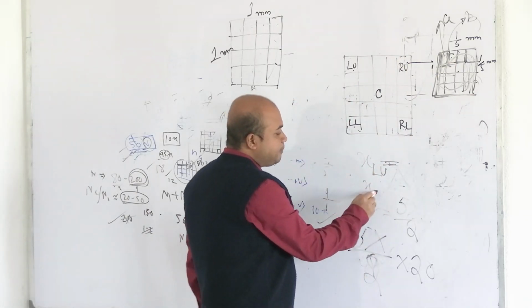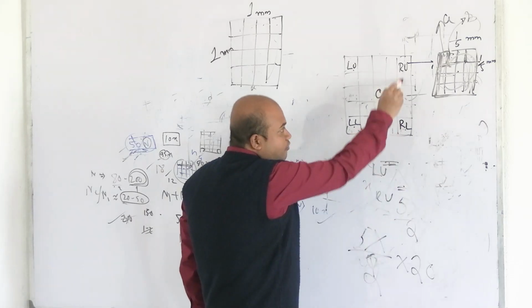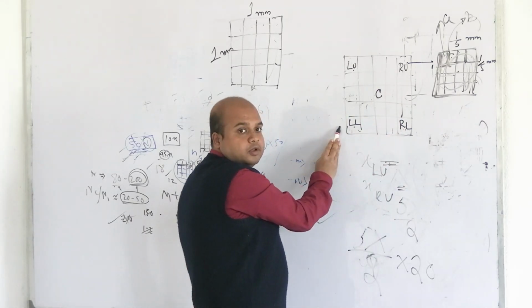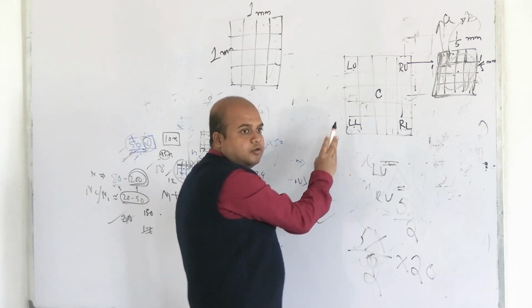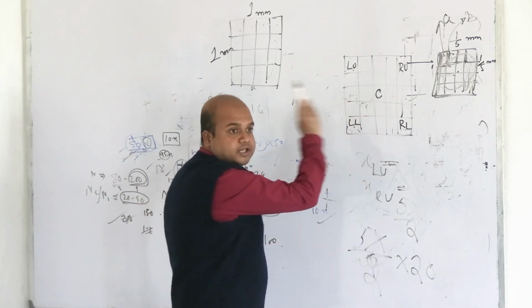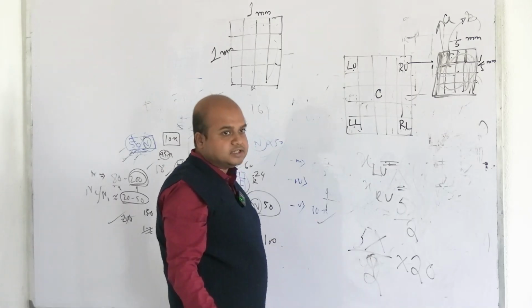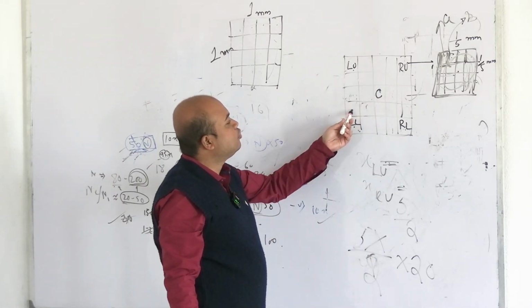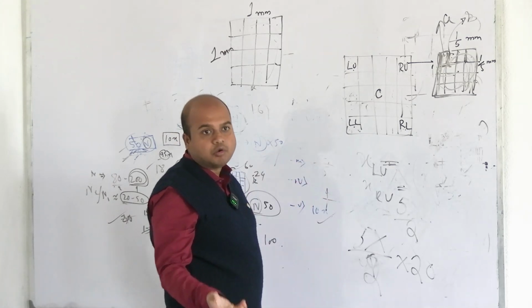So write x right upper is equal to so many. After this come down 4 squares, after right lower go left 4 squares. For the central one from the left lower you have to go 2 squares up and 2 to the center. Again that is the same question. Instead of reaching the center, I could count any of the others if I have to count 5.